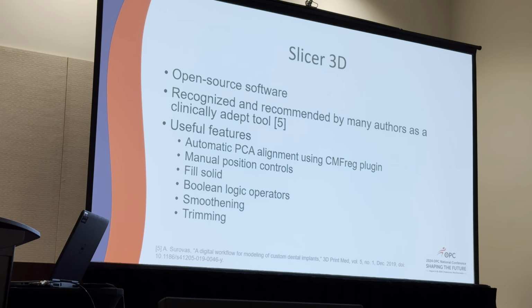One of the drawbacks of the previous system was that they expanded the scan of the limb universally and uniformly outwards. This is not the real world experience, as we know that residual limbs usually reduce in size in non-bony areas much more than in bony areas. And that's why we needed to have two different shapes, one on the inside of the insert and one on the outside of the insert.